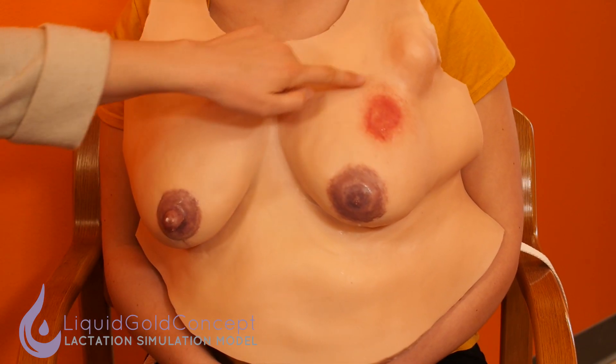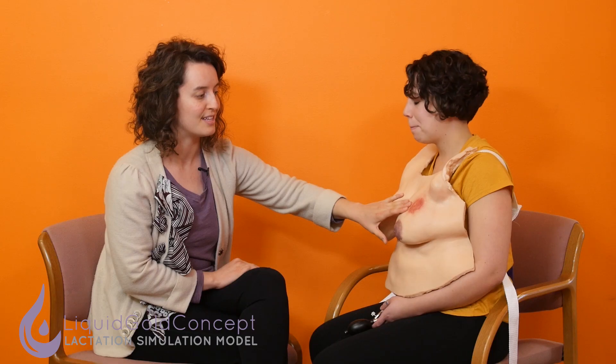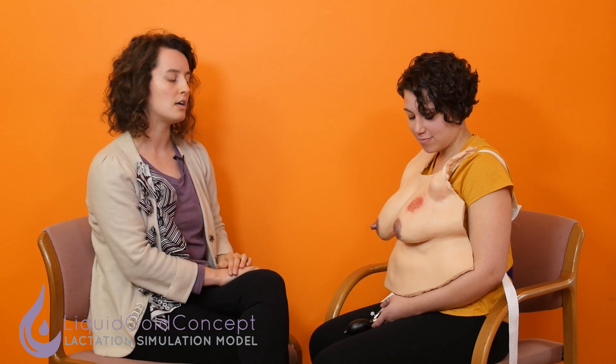You're probably noticing this pretty aggressive abscess on the left breast — this is really important for talking about the next steps of management beyond just mastitis and antibiotics. What do you do when a mom has an abscess? What are the next steps in counseling and strategy to make sure that her breast tissue can heal correctly?